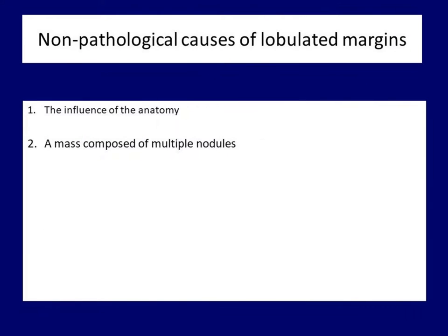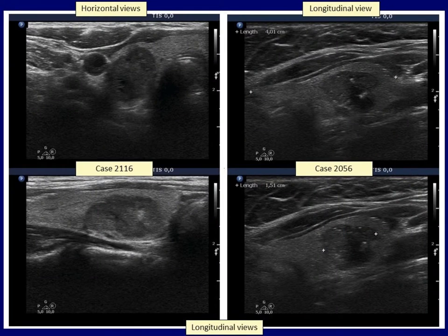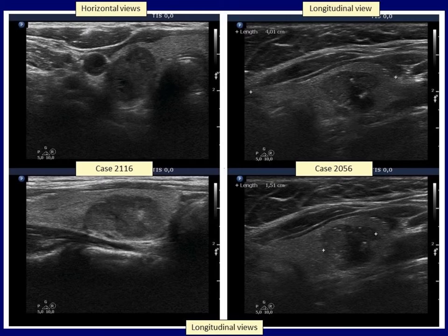The most challenging and frequently unresolvable problem is the issue of a complex nodular mass. This problem is again highly exposed to different interpretations. The nodular mass has irregular, undulated, speculated surface. However, irregular borders should always be referred to a single nodule. So the question is: are these masses composed of multiple nodules, or is this a single nodule? In the latter case, both the right and the left nodule have irregular borders; in the former, the borders cannot be held as irregular. The most important tool to resolve such an issue is the thorough and repeated real-time analysis of the video record. On still images, we cannot solve the problem.